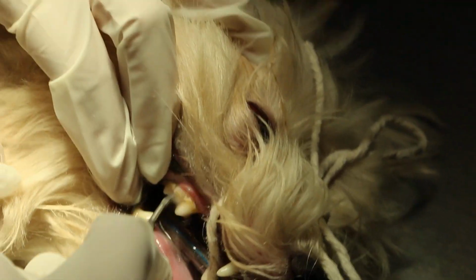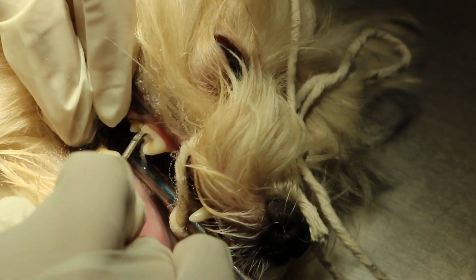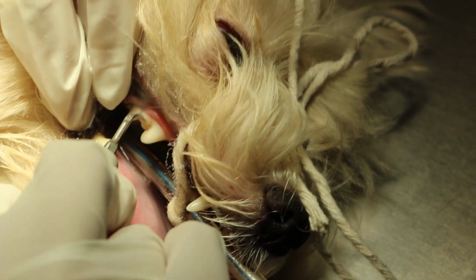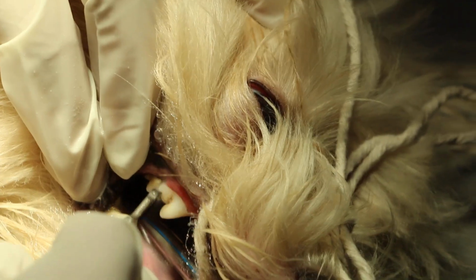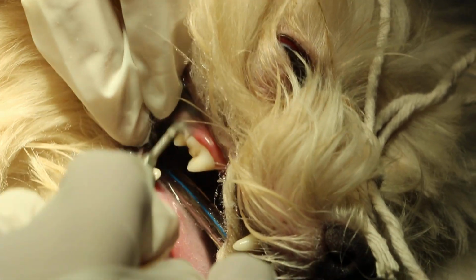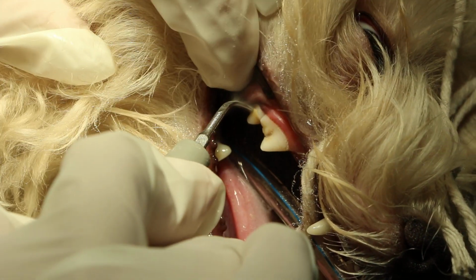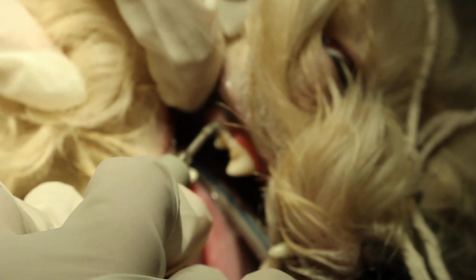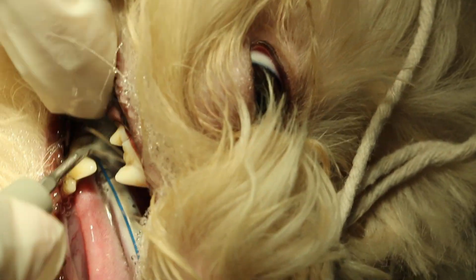After intubating the dog, connecting to 3% isoflurane as maintenance. We will do the scaling. This should be quite fast because there's not much tartar. The back teeth: this is the P4, premolar 4, and further on, molars 1 and 2. Further in. See, the dog is asleep already.